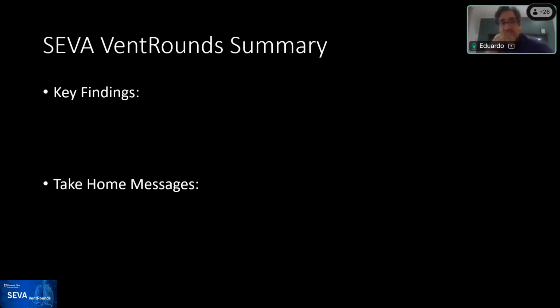Excellent. So why don't you round us out with some takeaway home messages for everybody, Karsten? Yeah, great. So I wanted to focus primarily on this: when we do this education, the question that we often get at the end is, how do I fix it? So I think highlighting the two key points of increasing the I time for someone that has an early cycle, or simply switching to pressure control CSV to potentially help with the patient's comfort and interaction with the ventilator, aside from being on PRVC.